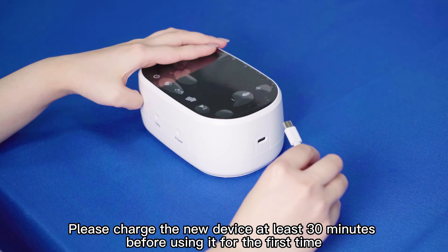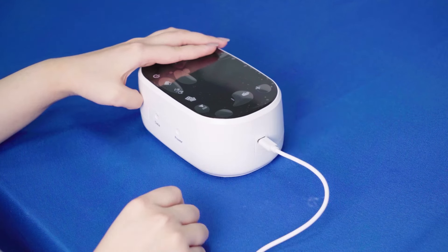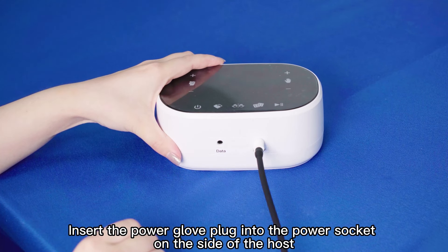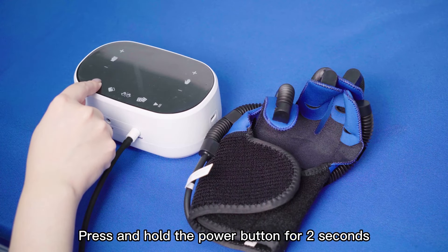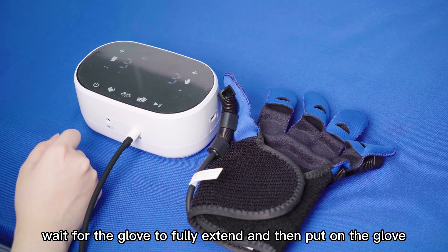Please charge the new device at least 30 minutes before using it for the first time. Insert the rehabilitation glove plug into the power socket on the side of the host. Press and hold the power button for 2 seconds. Wait for the glove to fully extend and then put on the glove.